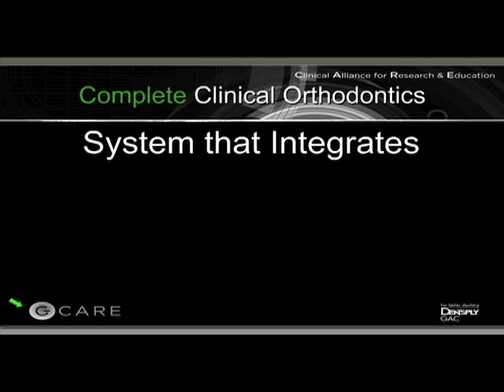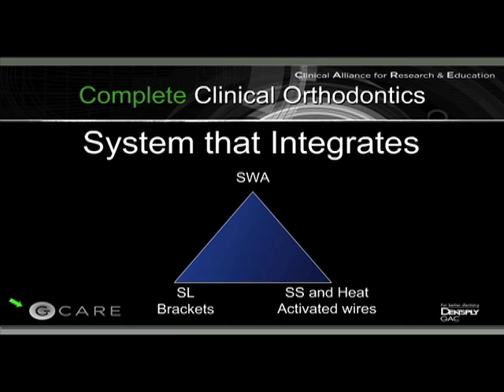CCO, or Complete Clinical Orthodontics, is a system that integrates three different technologies that we have had for a long time. The first one is the straight wire appliance that, as we all know, has been with us for more than 40 years, 42 years to be very precise. Also, self-ligating brackets that, even though the first system was developed in the 30s, it wasn't until about 15 years ago, specifically around 2000, that they started becoming more popular.